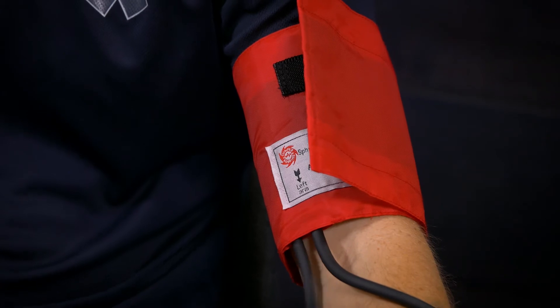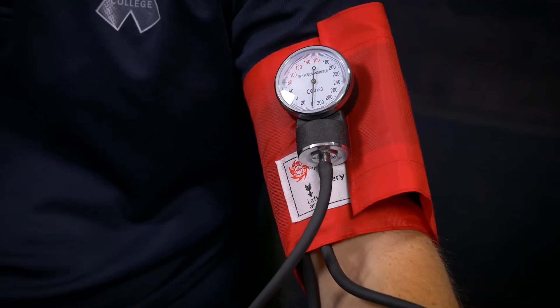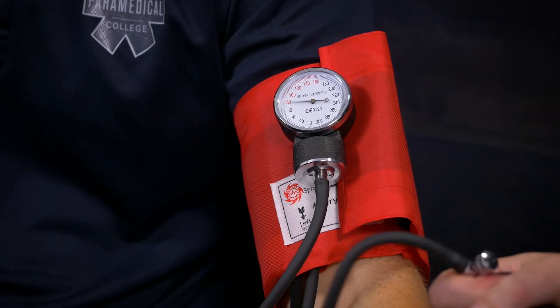Take my sphygmo, pop it up there. So feeling for a pulse — which I have there. Slowly pump up the cuff. Okay, pulse... and I've lost the pulse now. So a little bit higher, slowly coming down.